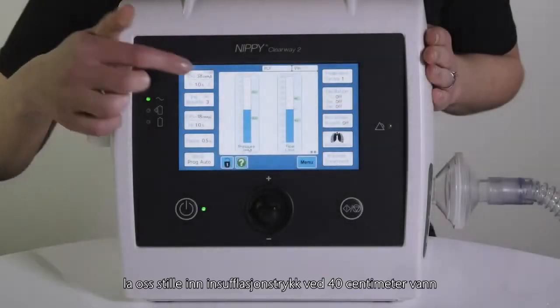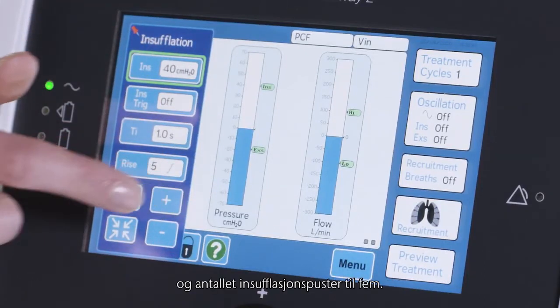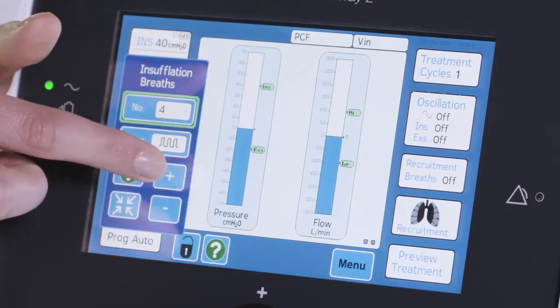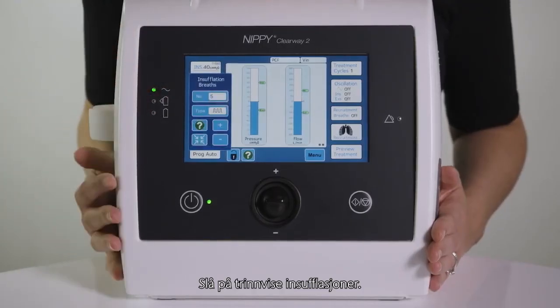For example, let's set insufflation pressure at 40 cm of water and the number of insufflation breaths to 5, then switch on stepped insufflations.